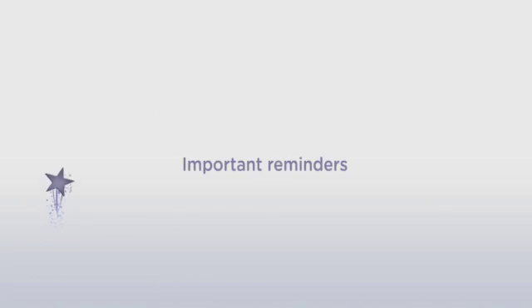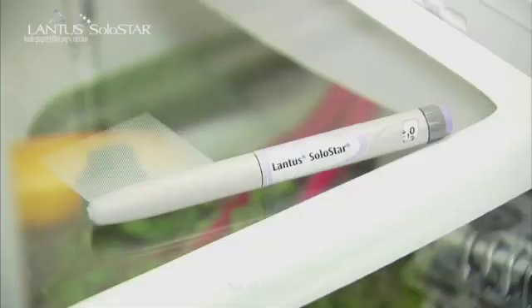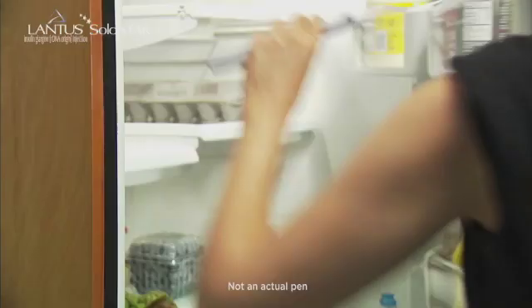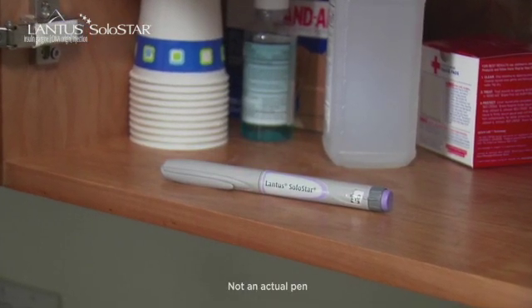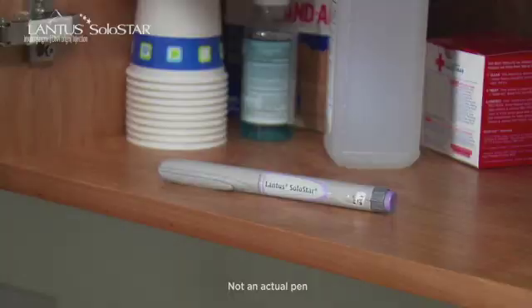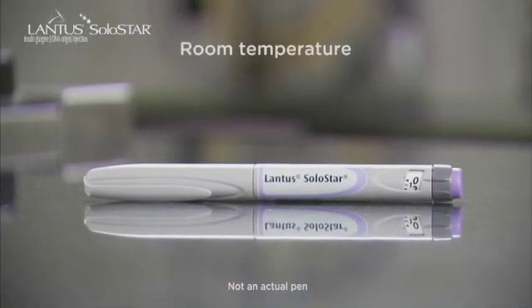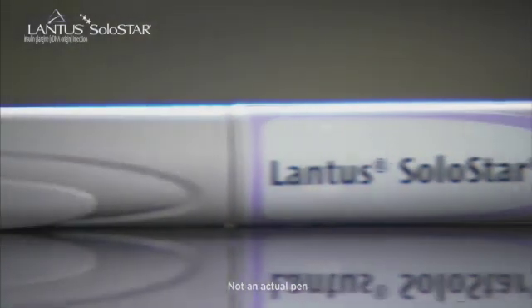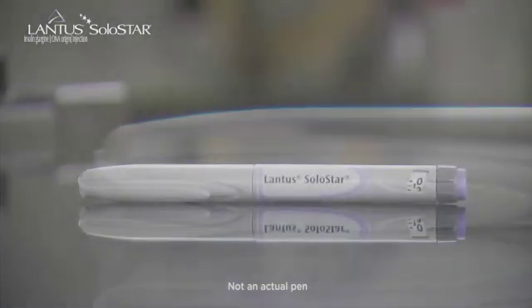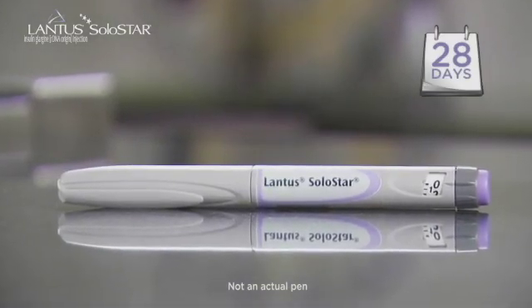Before we start with Step 1, here are some important reminders about using the pen. Store unopened Lantus Solostar pens in the refrigerator until the expiration date. You can also store unopened pens at room temperature, but only for 28 days. Before injecting, wait until the pen has been out of the refrigerator and warms up to room temperature, so the insulin in the pen will feel more comfortable when you inject it. After opening the pen, you should not refrigerate it, and you can use it for up to 28 days.